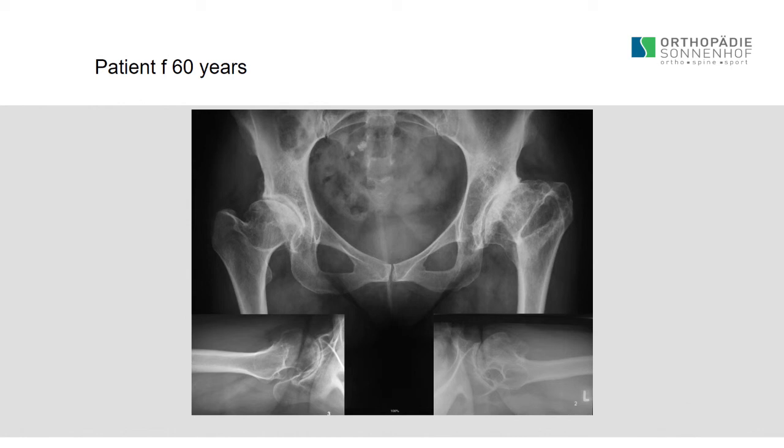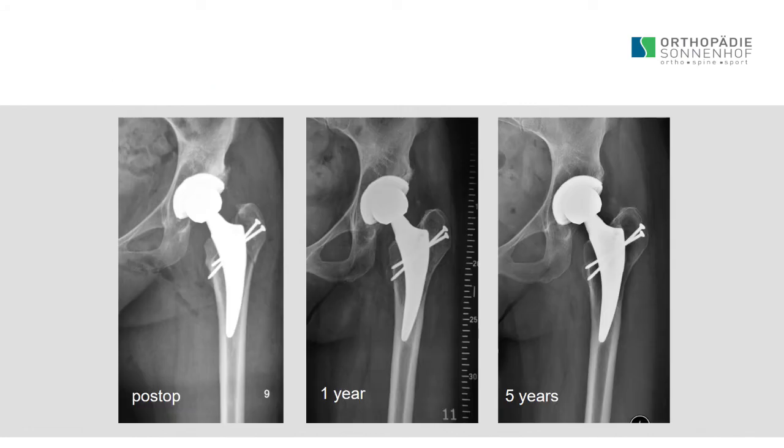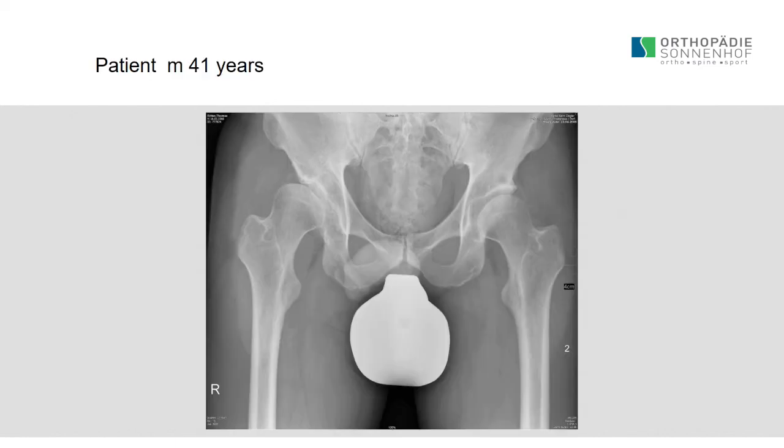Similar here. In this case, we could have done also a conical stem because it's a quite difficult situation on the left side. And you see we had quite some difficulty to adapt the prosthesis to the proximal femur. So this one is in a valgus position, which may be not ideal, even if it is absolutely stable and the patient pain-free.